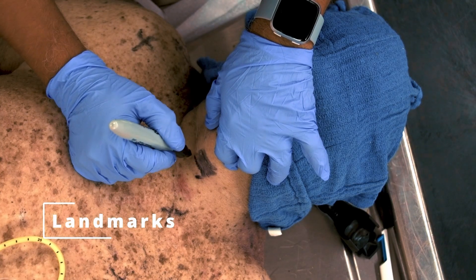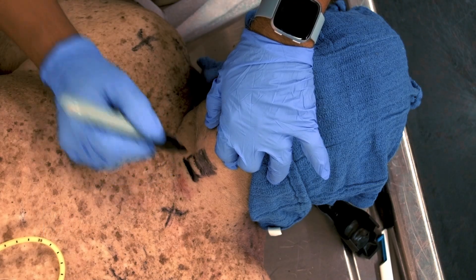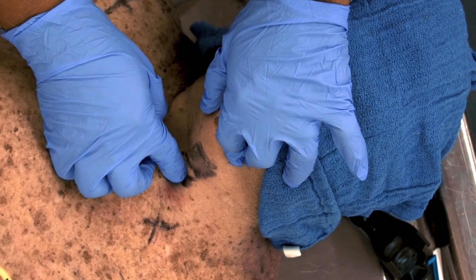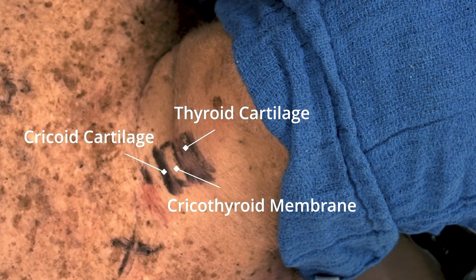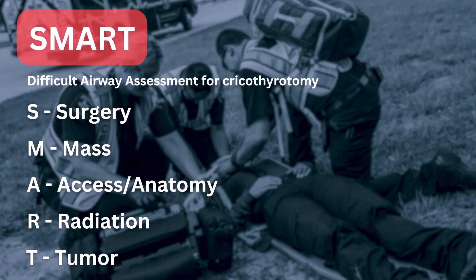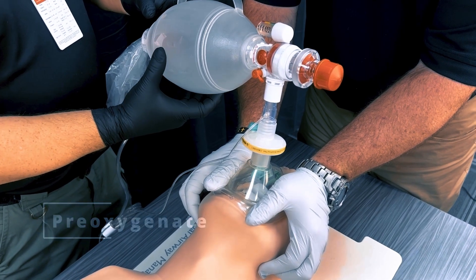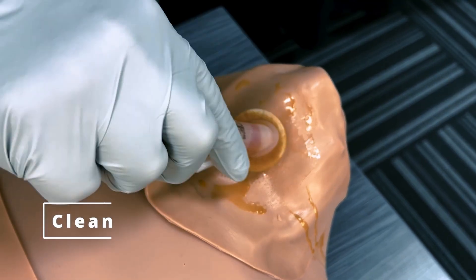In preparation for the procedure, identify the airway landmarks and mark the location of the cricothyroid membrane. The thyroid cartilage, the cricothyroid membrane, and the cricoid cartilage are identified. Use the SMART mnemonic to assess for any potential difficulties when performing a surgical airway. If possible, pre-oxygenate the patient. Clean the anterior neck with chlorhexidine or the provided disinfecting agent.